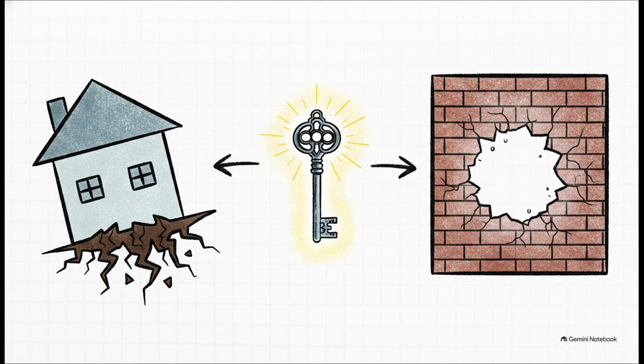So the absolutely crucial point here is knowing what to do when you actually find a structural failure. That's where our high-stakes skull decoders come into play. If the foundation fails and you've got basilar invagination, I want you to think COOP. That's congenital, osteogenesis imperfecta, osteomalacia, and Paget disease. Now, if you find a hole in the wall, a solitary osteolytic defect, use Help Me. Hemangioma, epidermoid, leptomeningeal cyst, Paget, post-surgical, metastasis, and eosinophilic granuloma. And look, I don't want you to frame these as just extra memorization. Treat them as emergency retrieval tools to decode the image when you're under clinical pressure.